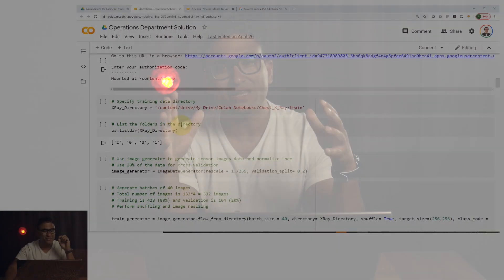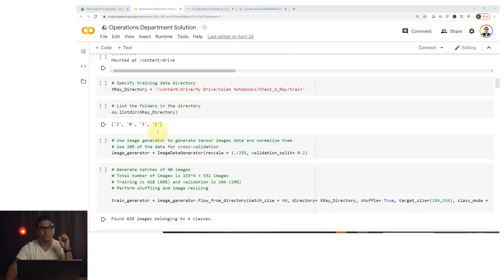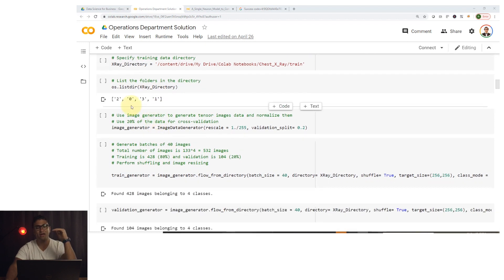Hello everyone and welcome to this new video. In this video I will be showing you a full demo on how to use machine and deep learning to detect and classify COVID-19, also known as coronavirus, based on x-ray chest data.